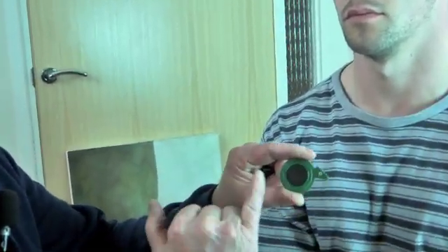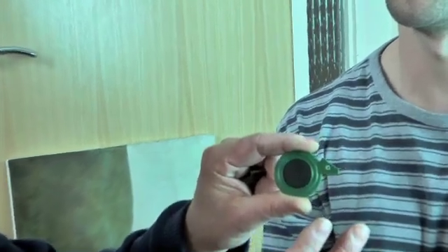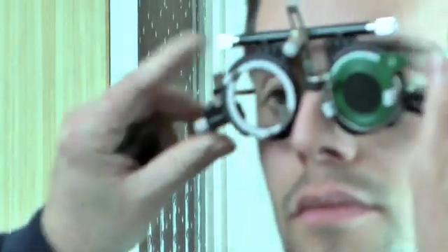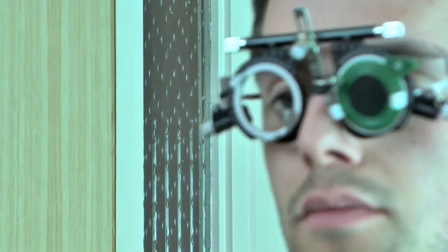The first thing we have to do is occlude the left eye. This is the occluder - just a disc with no holes, just a black disc. That will then fit into the trial frame and prevent them from seeing with the left eye.